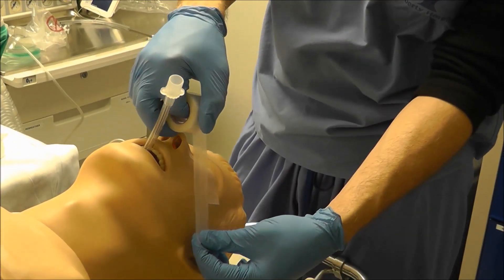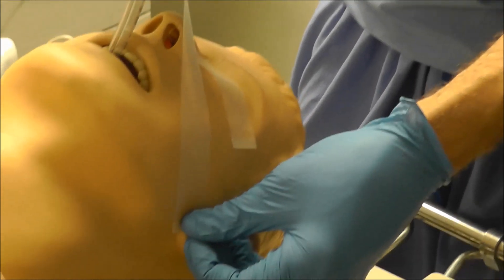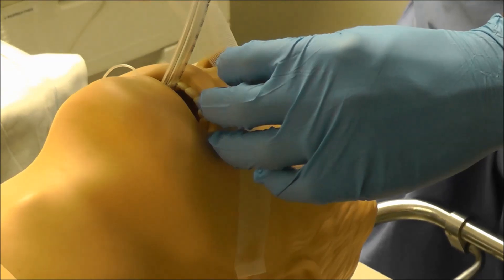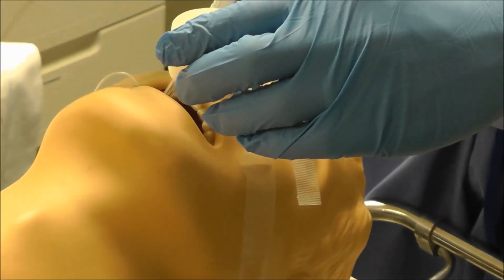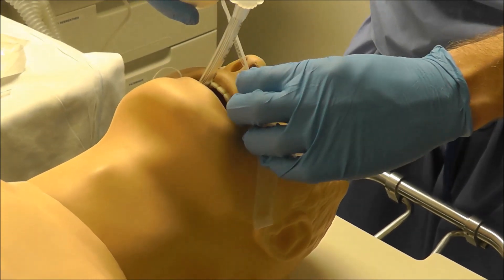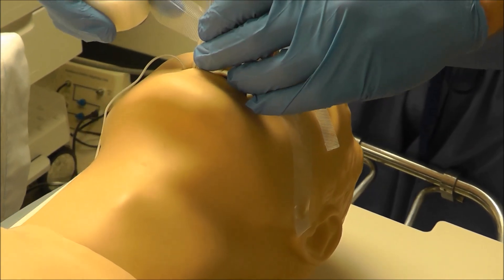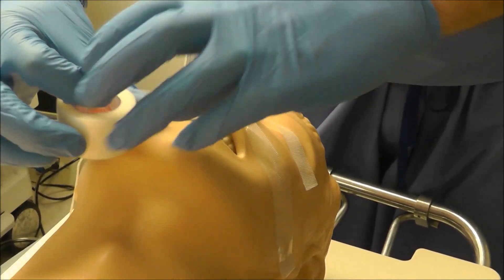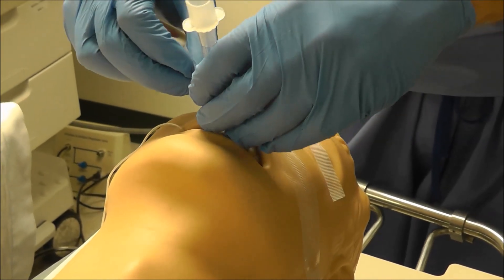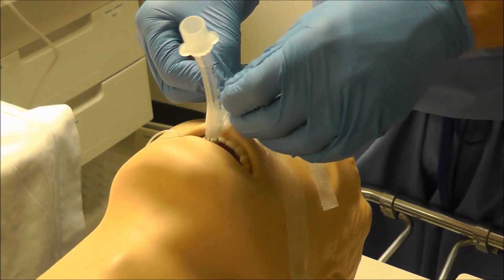I'll just come over like this and stick it on. The number one thing is to make sure that you're taping it as close to the face as possible. You don't want to tape it up high because then it can move and come out. I get as close to the face as I can and then I wrap it around twice. You try to not tape the lip to cause damage to the lip.